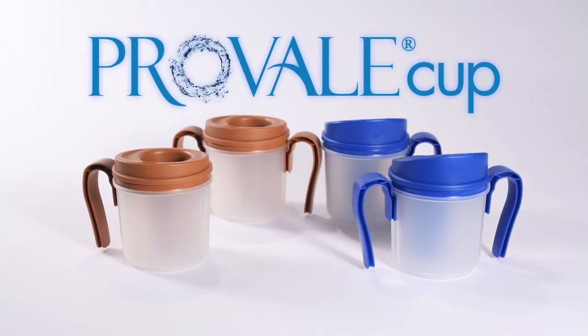The ProVail Cup is a new way to deliver a fixed volume of thin liquids for patients and residents. It is simple, easy to use, and delivers an accurate and fixed amount of liquid. We look forward to serving your needs with the ProVail Cup.